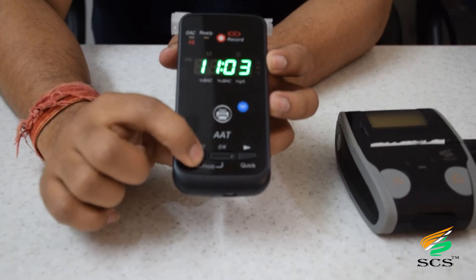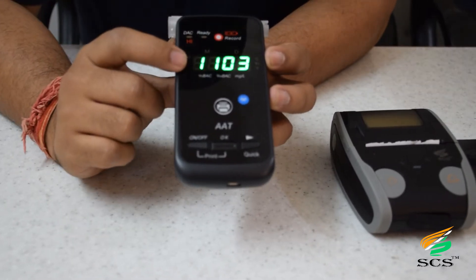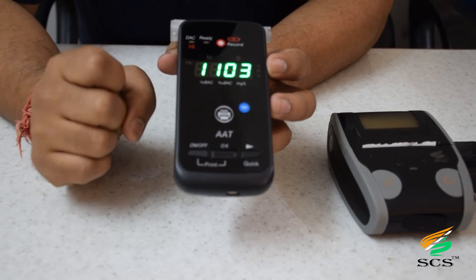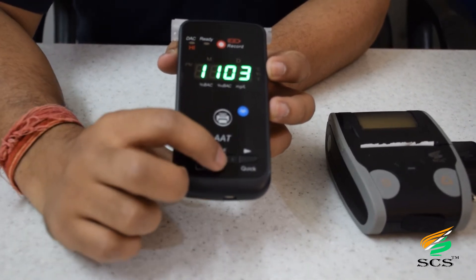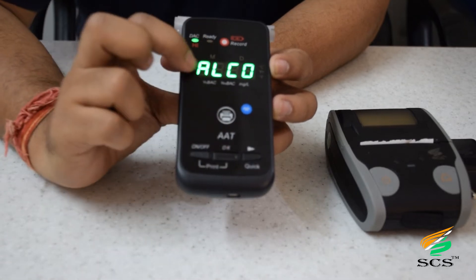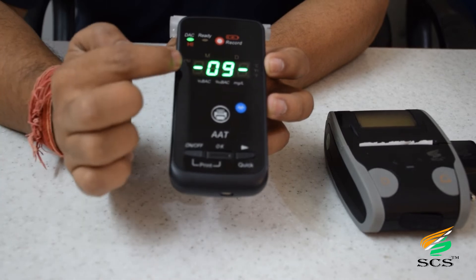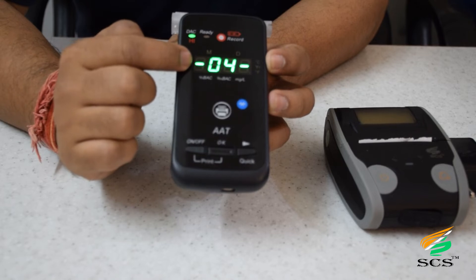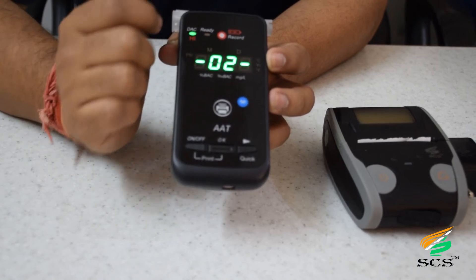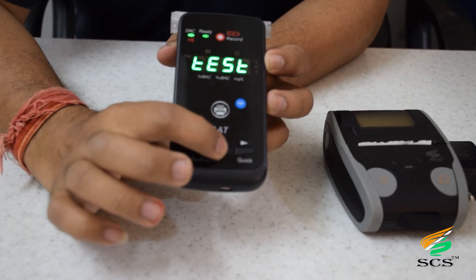Hold the button to power on — it shows the date and time on the first screen. To take a test, click OK; it will show 'alcohol.' Click OK again and the reverse countdown will start. After this, we need to blow into the mouthpiece, then click the OK button.